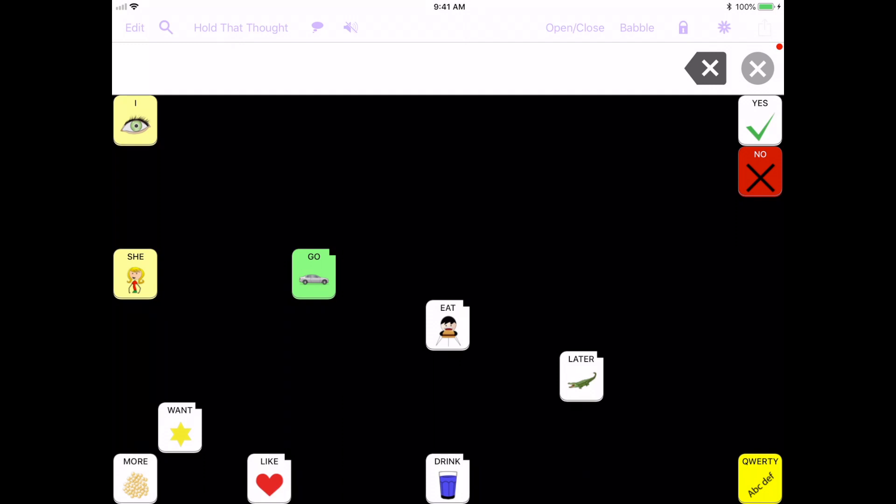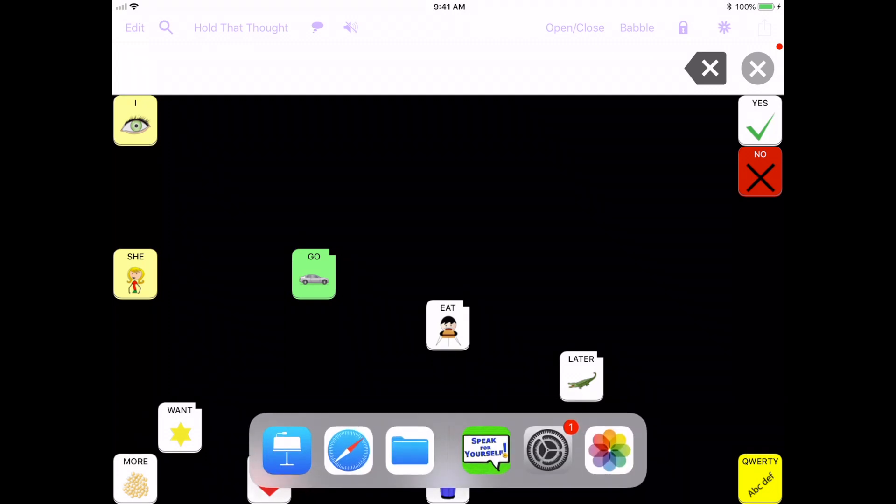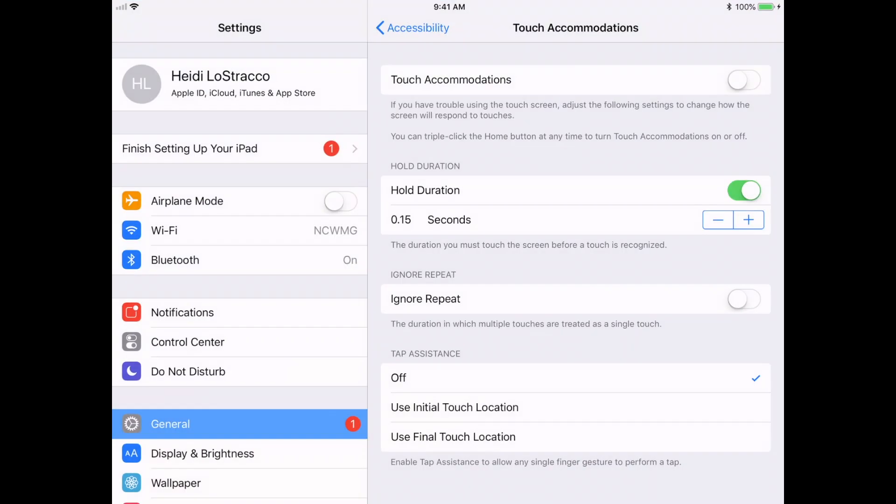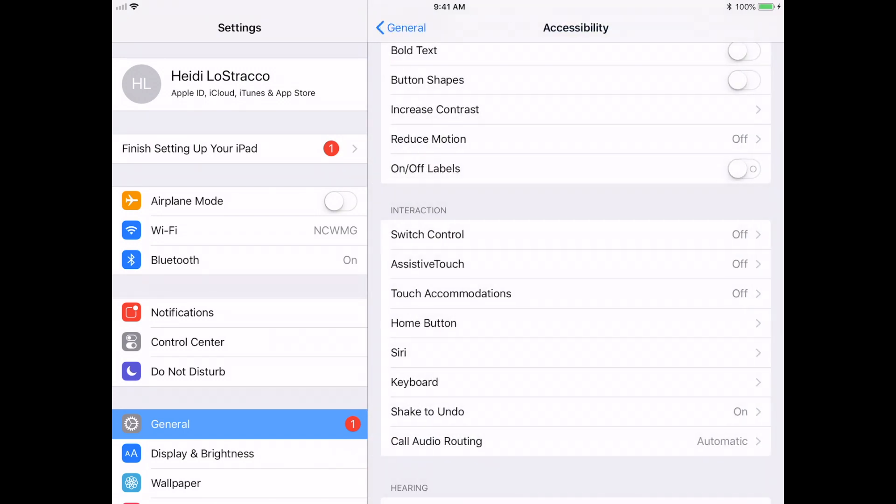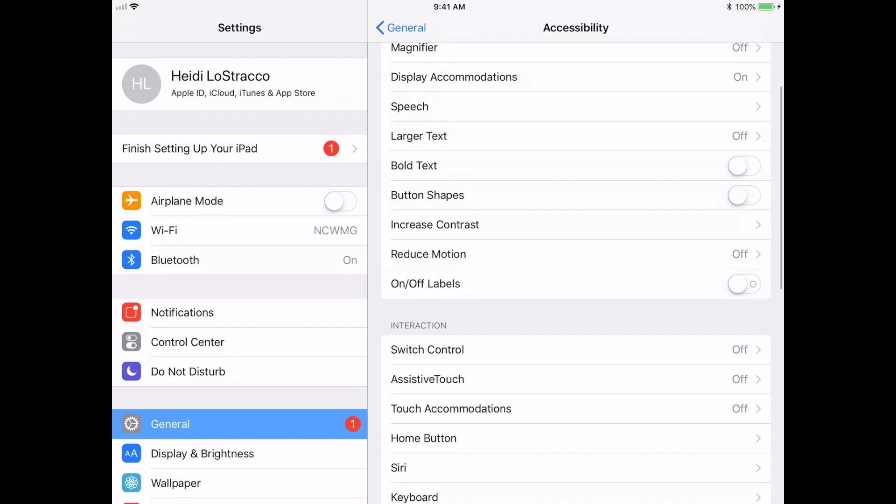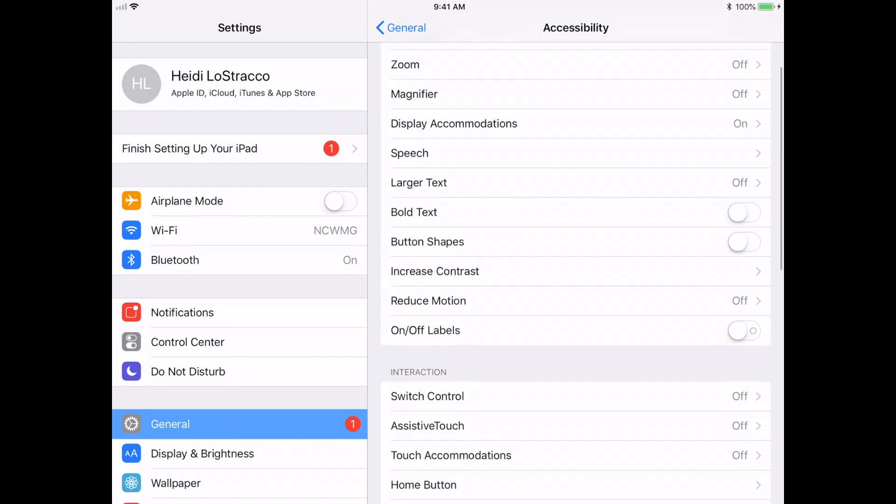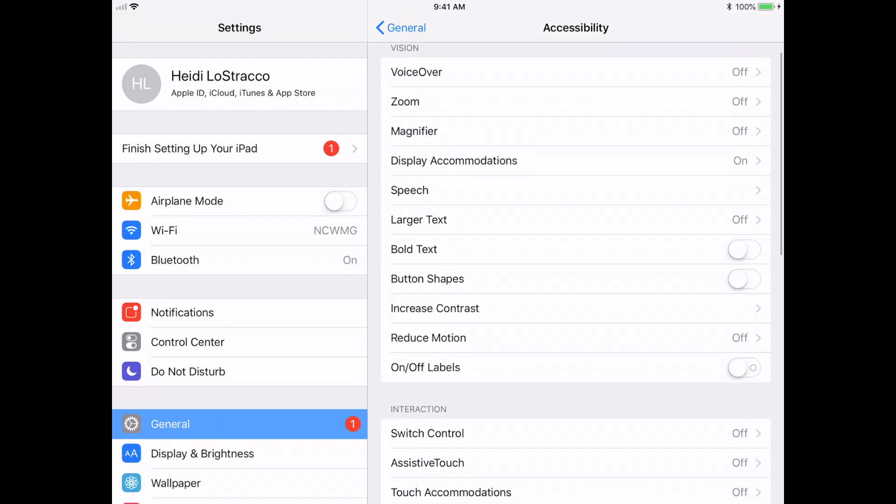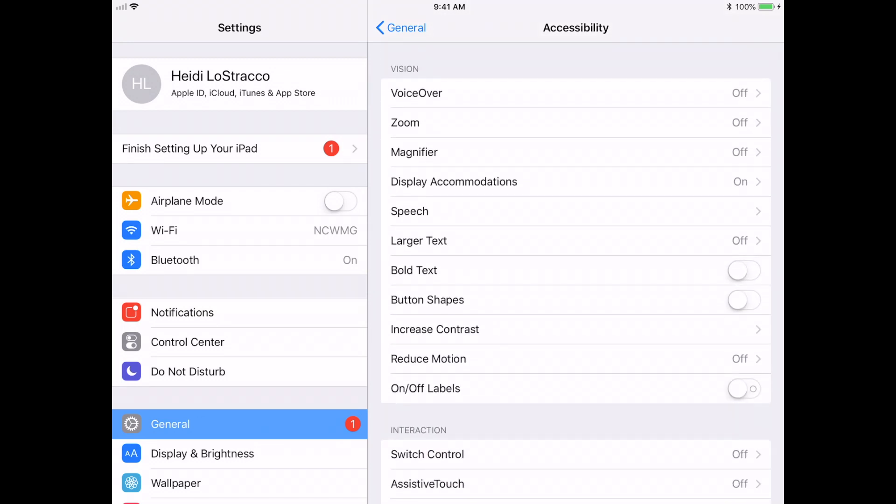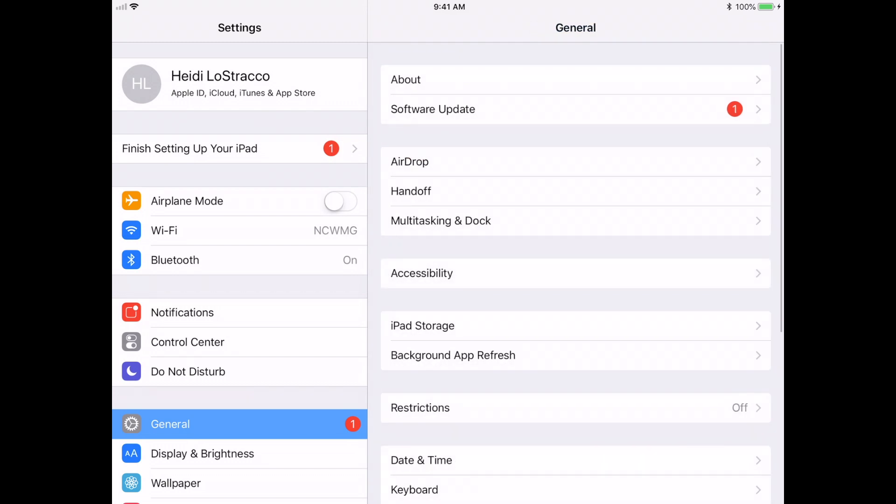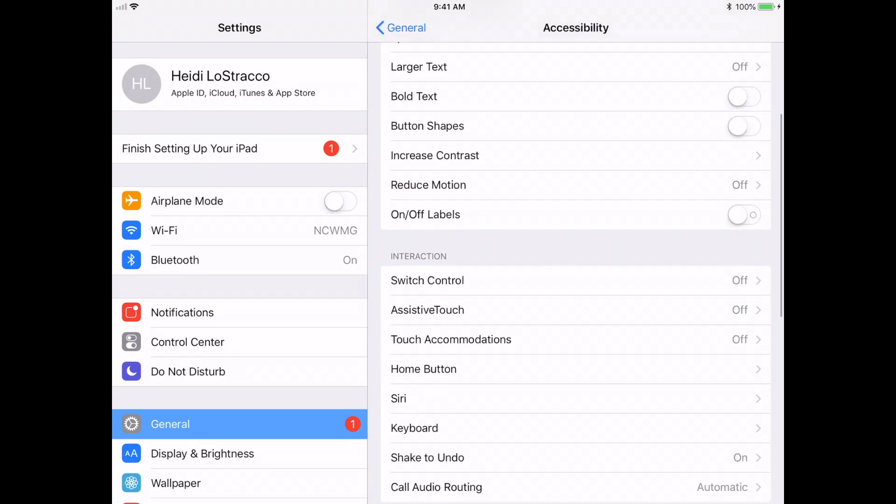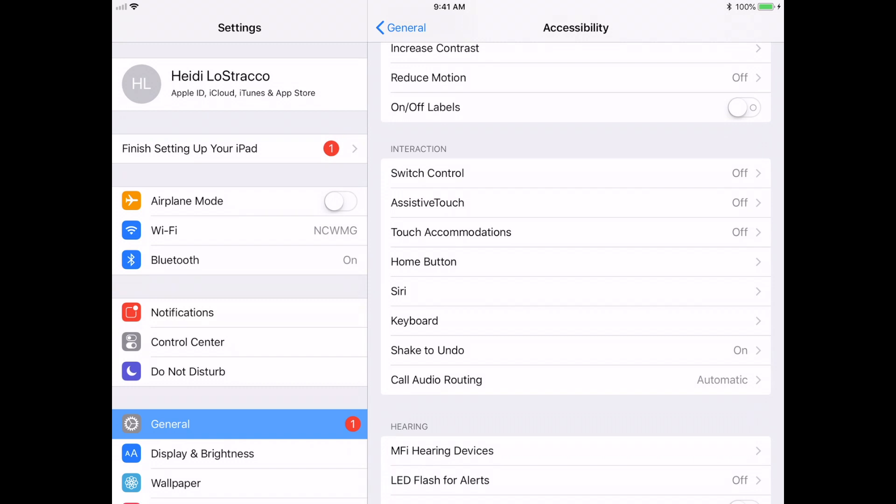You would go into the settings of the iPad. So I'm just going to swipe up here so I can get into settings. And then to get to the touch accommodations, I'm just going to back up a little bit so you can see along the left hand side you would go into general. And then if you scroll down here, go into accessibility, so you go from general then to accessibility. And then if you scroll down here you see all of your different accessibility features that are built into the iPad.